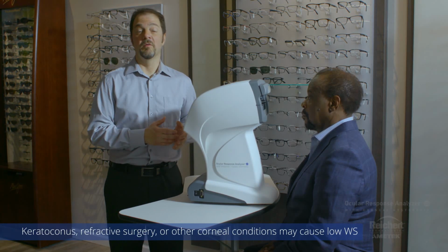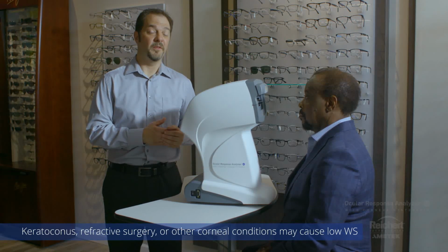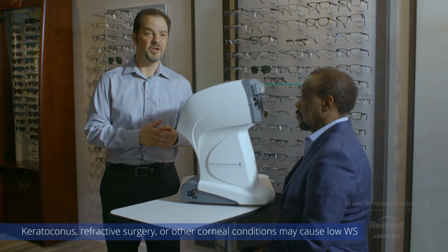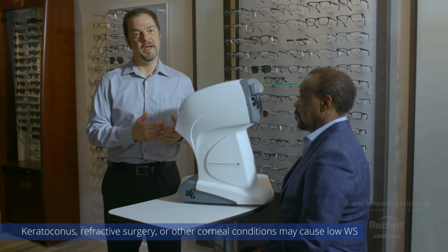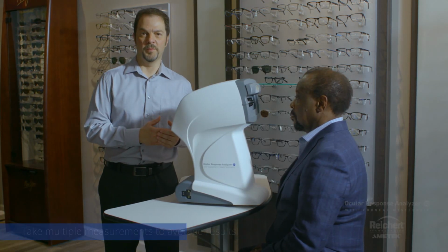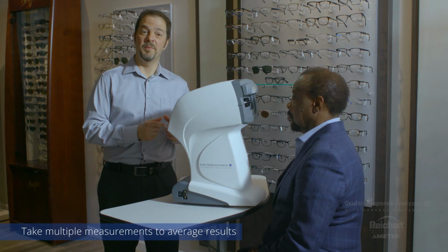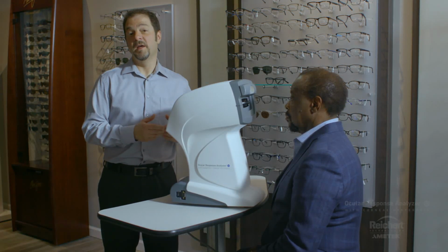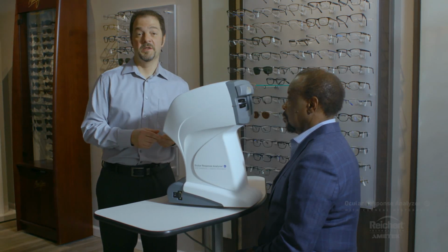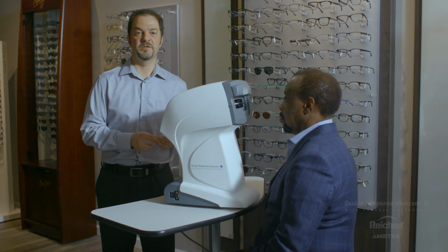Patients that have had recent ocular surgery or refractive surgery, or patients who have pathology such as keratoconus or Fuchs dystrophy, these are the types of patients that may generate low waveform scores and that there may be nothing you can do about it. In these cases, I advise you to take multiple measurements and let the instrument's intelligent averaging system average the best quality measurements available. If you make 3 measurements in a row with the instrument and you get a waveform score of 3, 7, and 8, it's only going to measure the 7 and 8. That's how the intelligent averaging system works.